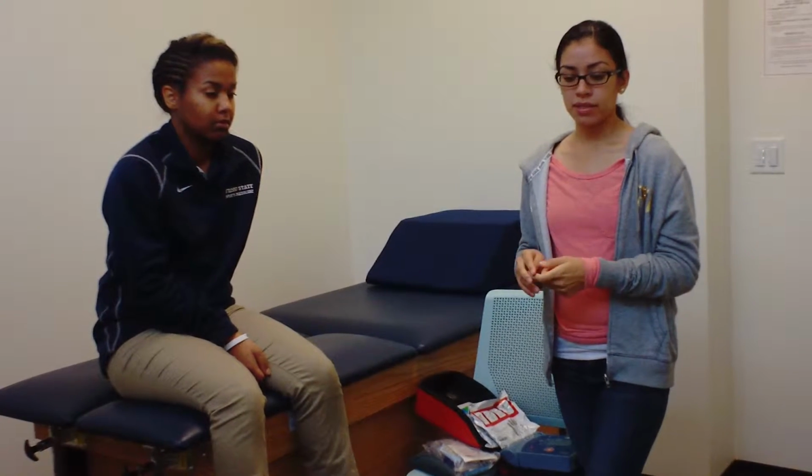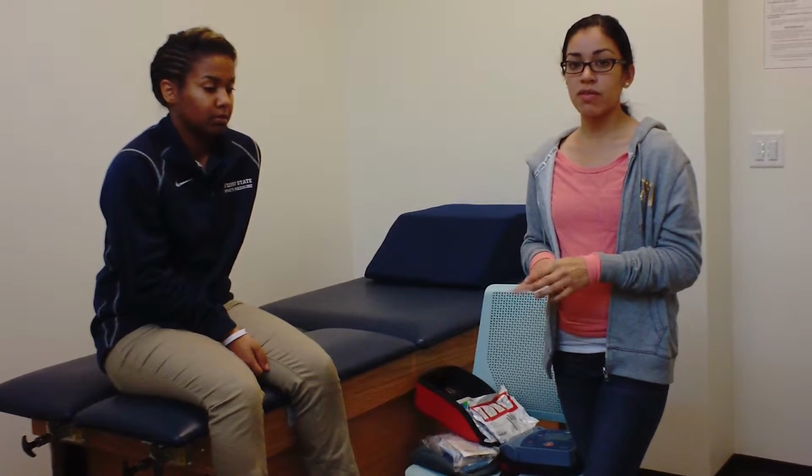The first thing I want to do is check the patient. I'm going to assess ABCs, which are airway, breathing, and circulation. If they are breathing, but it's somewhat irregular, and if their circulation is not good, for instance, if their pulse is absent or irregular, I'm going to proceed with CPR and or grab an AED as soon as possible.